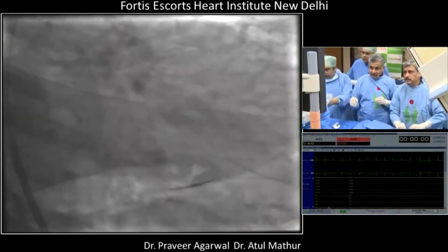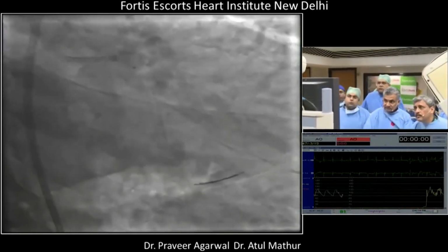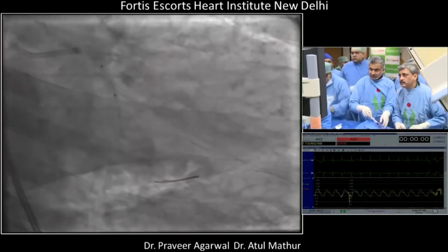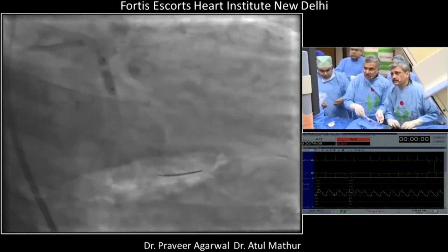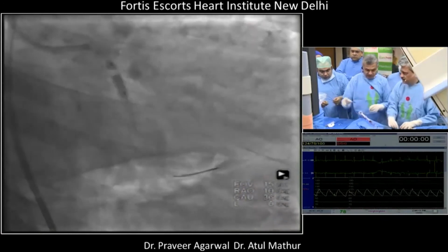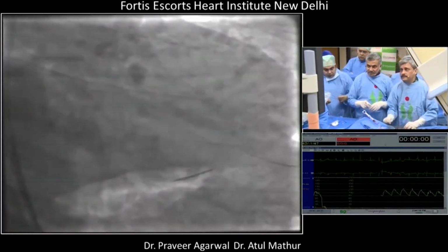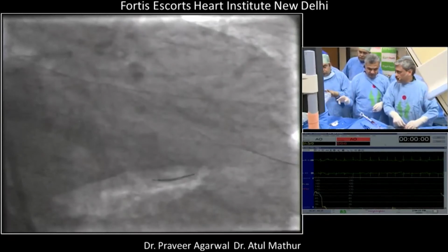There is a lot of resistance. Okay, go up. 6, 8, 10, 12, 14. This is a 3.5. Now try go up and down. See that? So this is still post-dilatation. When you say POT, you expect it to be a shorter 6 millimeter balloon, just proximal to the carina.